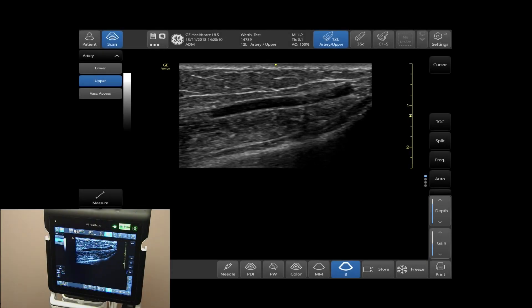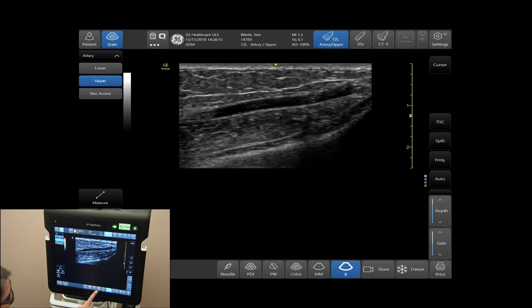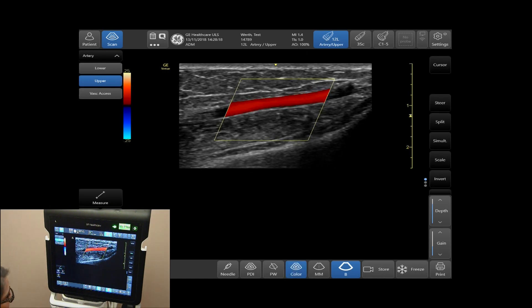Optimizing Color Mode Image. To activate the color, simply tap Color on the bottom of your screen.